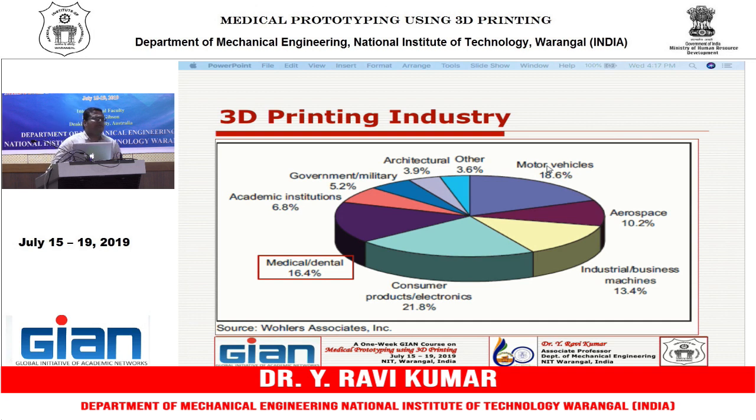Yeah, the planning can be done even with machined components also. Any specific thing? Of course, one thing is the complexity. The anatomy is more complex than any product. As an engineer, you can design very complex designs, but anatomy is God's design, so it may still be complicated, and wherever you have complexity, with 3D printing you can get that complexity free of cost.